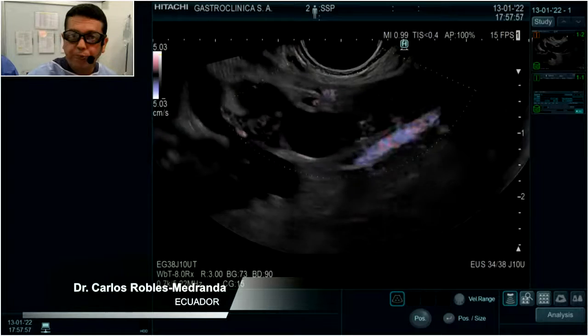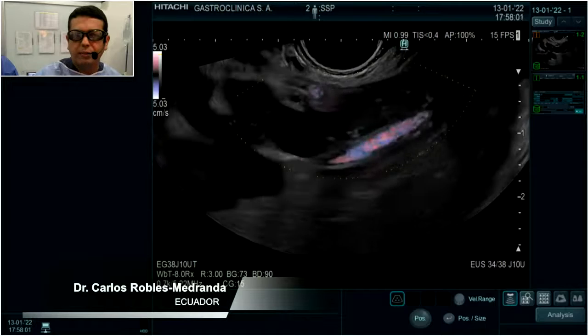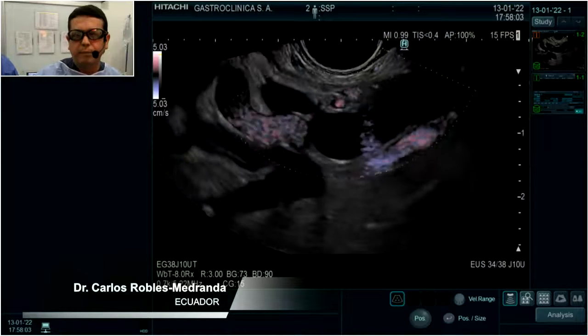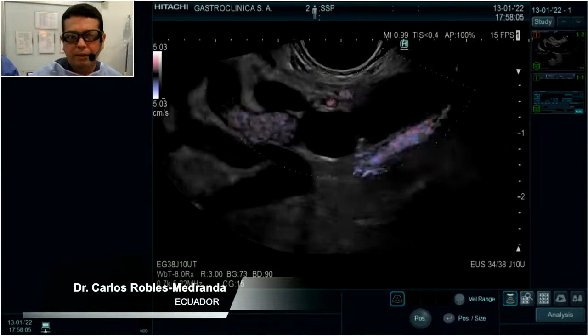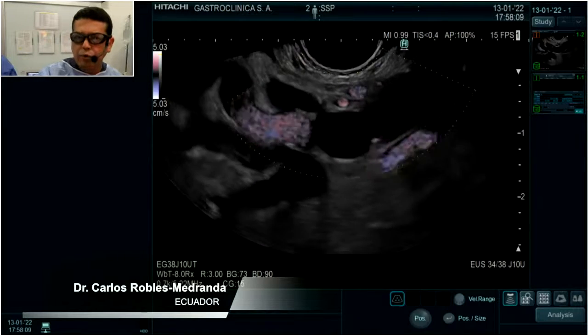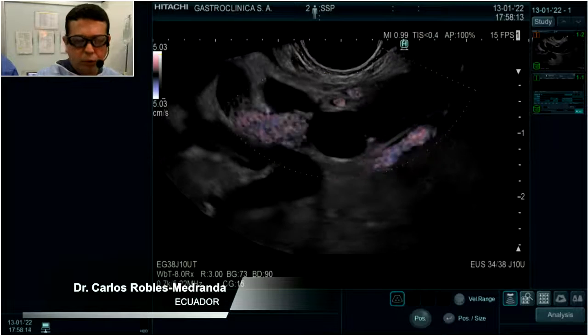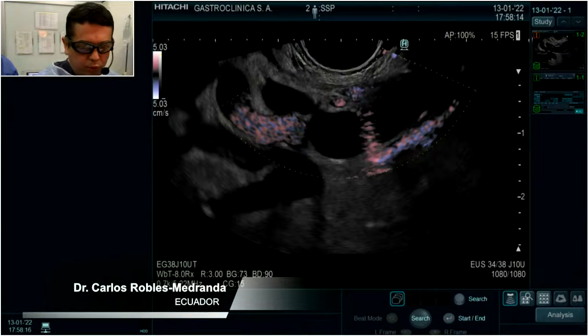Some options were proposed many years ago, such as using enteroscopy, but this is a time-consuming procedure. So today I will try to show you what we can do, and to evaluate the strategy to do a very good treatment in this patient.